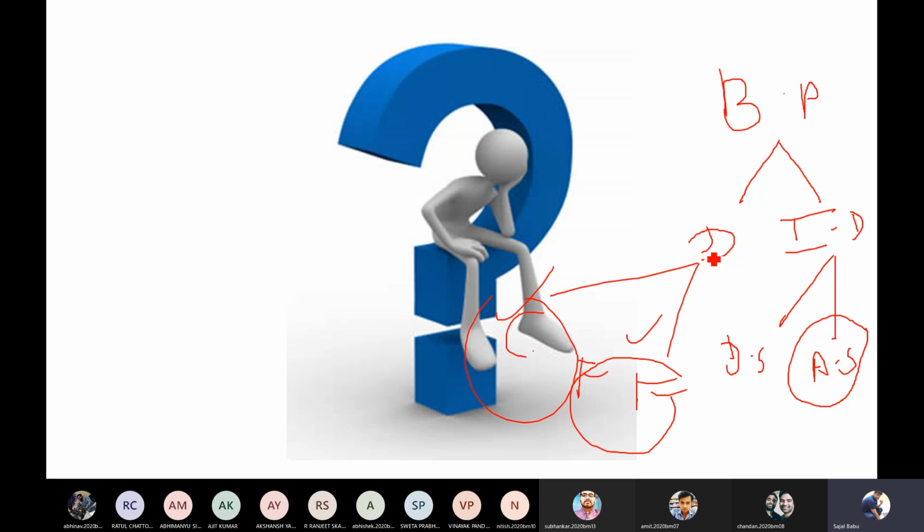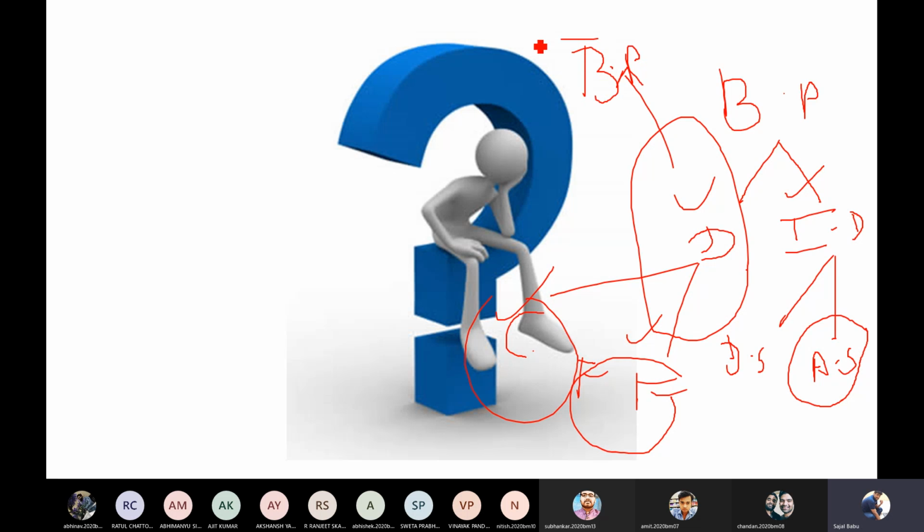Okay, and if you are asked which is more advantageous, the direct method or the indirect method, the direct method is more advantageous, because the reading it measures will be accurate, since it is measured directly from the blood. The other advantage is that here you can get a continuous reading, for 24 hours or 48 hours.